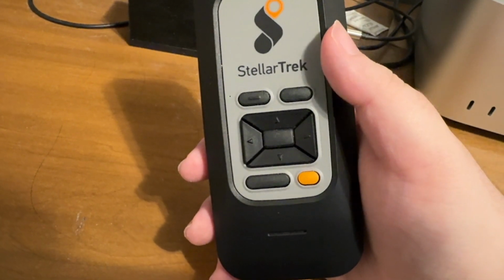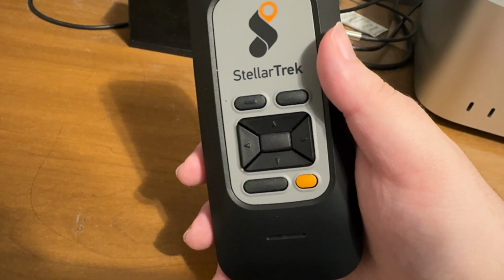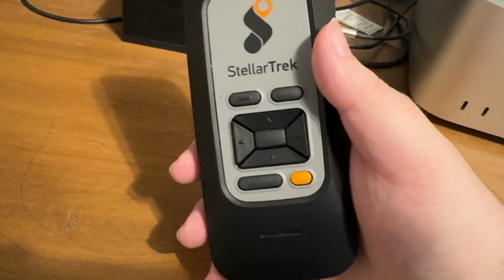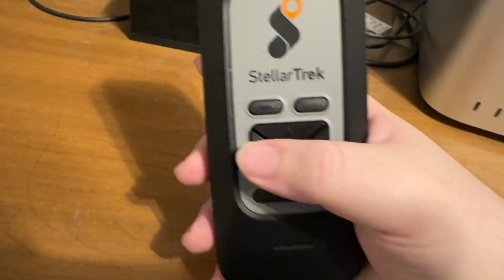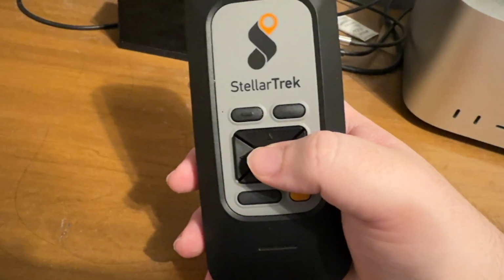Select a landmark as your destination. 5 landmarks. Home sweet home. Quincy, Massachusetts. Press confirm to start route in pedestrian mode. It put us on the first landmark, which is home sweet home. So I'm going to press the left arrow so we can get to sort. Press it again to get to enter an address. So this is what we want to do.